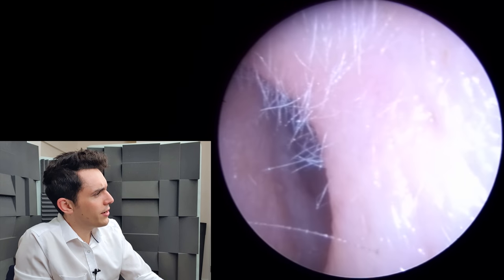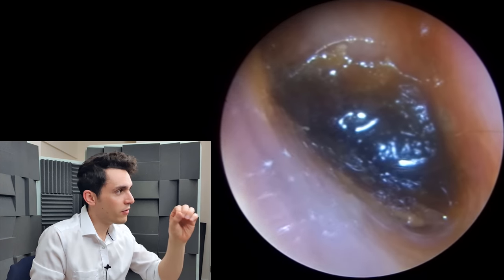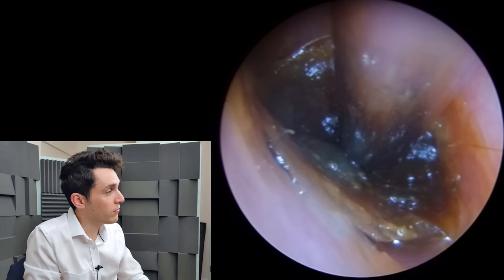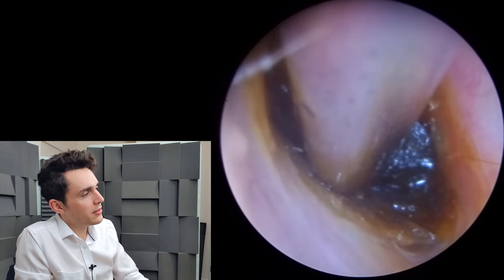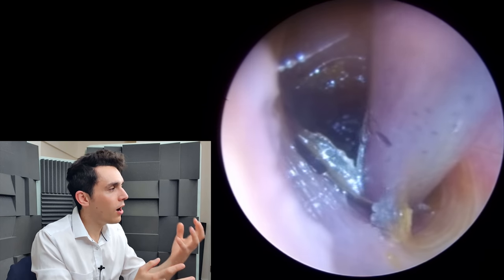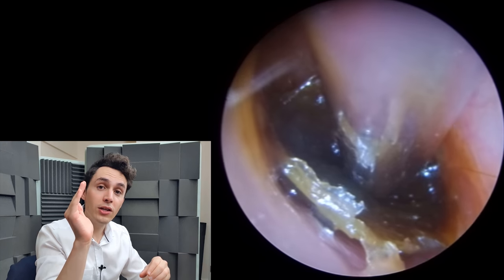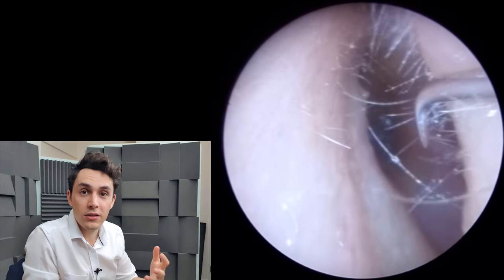I'm going in here now with a regular sized suction probe. What you've seen before is called a fine end — it's a suction probe with a smaller diameter. This is a regular one, and you can see just the power of it, sucking up all the excess olive oil. Even this is not making much progress, and it's not necessarily because the suction is too weak. It's just that the surface of the plug is so hard and crusty, and it's concave — the suction probe cannot latch onto it. A concave surface and a suction probe are not going to interface well.